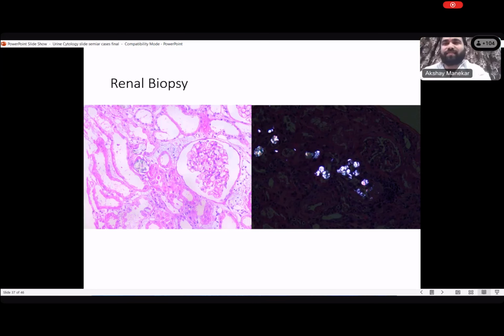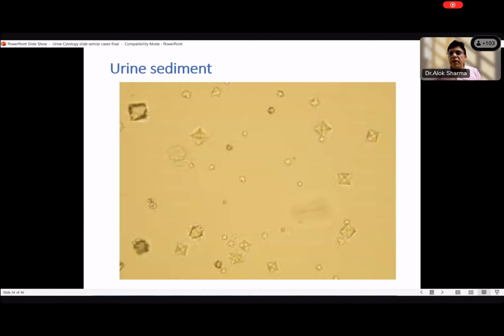Birefringent, right? Shining, don't call it shining. So shining is something when you reflect on something, right? So this is a specific scientific process. Okay. So on cross-polarized light, these are birefringent. Okay. So does it have anything to do with the morphology, that birefringence? So if I was to polarize this particular image slide, will the crystals appear the same as in the biopsy? Right. So are you aware of any other oxalate crystals which will not do this?